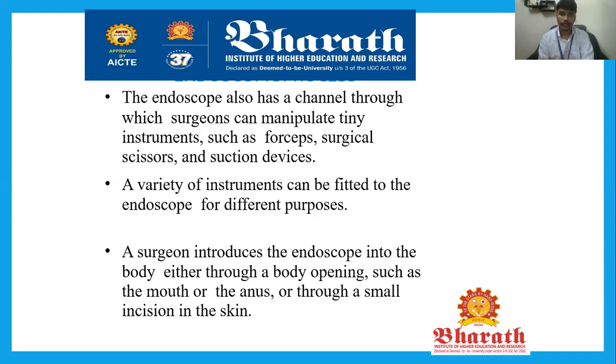If you want to find the real image or internal image of the intestine or abdomen, people will insert the endoscope through the anus. And this is not recommended for all age categories of patients. People with real need and risk for providing the treatment will go for the insertion of the endoscope through the anus.